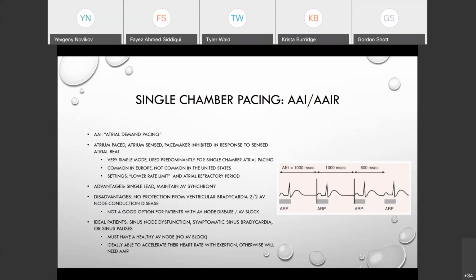The ideal patient here is going to be your patients with sinus node dysfunction, symptomatic sinus bradycardia, or sinus pauses. And again, as I've mentioned a couple times now, you have to have a healthy AV node or no evidence of AV block to do this.